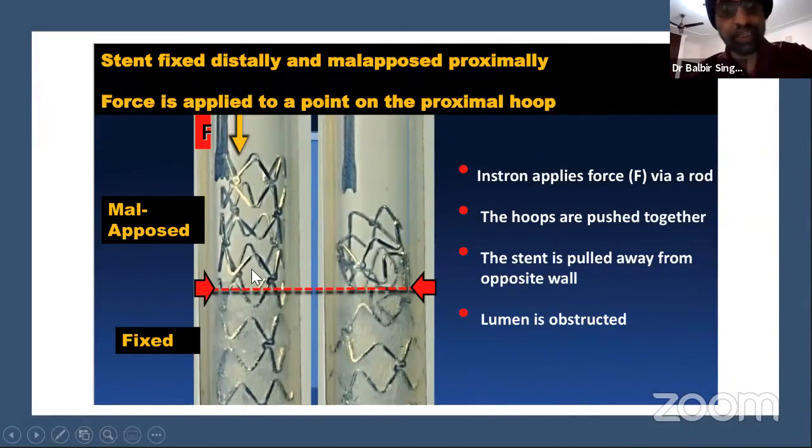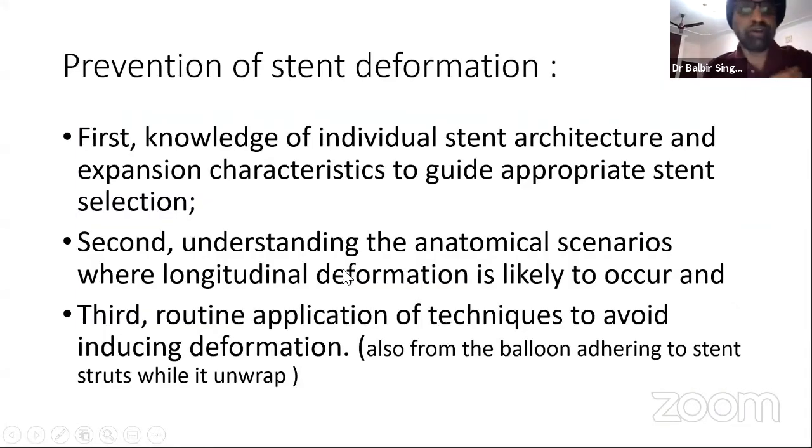Now, this is an elegant diagram to show what happens. Once you have the stent in, you have some malposition in the proximal part, you bring in the next balloon or the device or the intravascular ultrasound, you would hang on the edge of the stent and that deforms. So you keep pushing the device thinking that it's not going, so let me push a little harder, and it becomes more and more deformed. And this is where the problem actually comes. So how do we prevent?